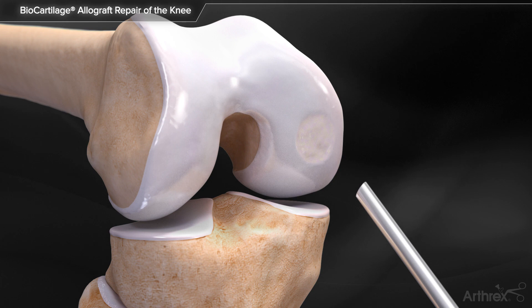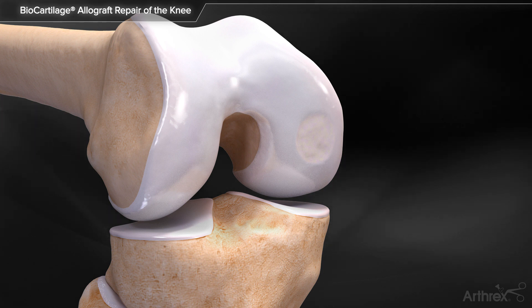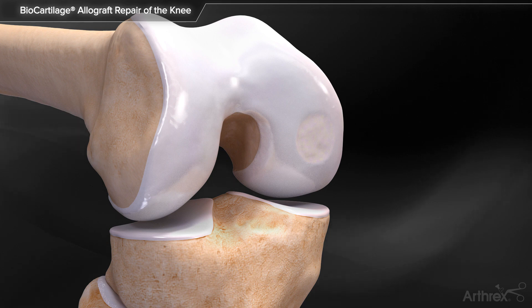Biocartilage extracellular matrix acts as a scaffold to augment articular cartilage repair and may potentially signal autologous cellular interactions and improve the degree and quality of tissue healing within a properly prepared articular cartilage defect.